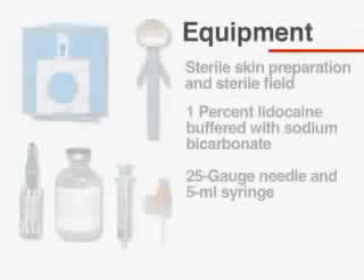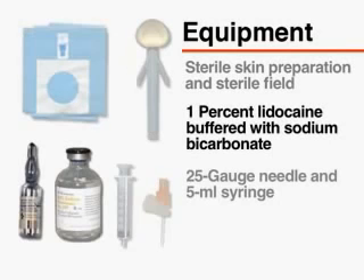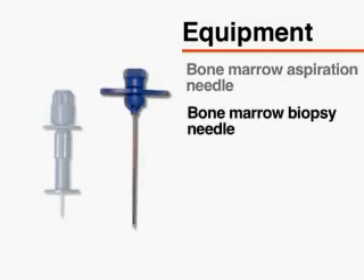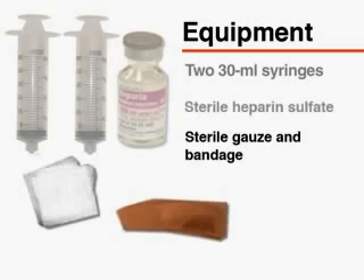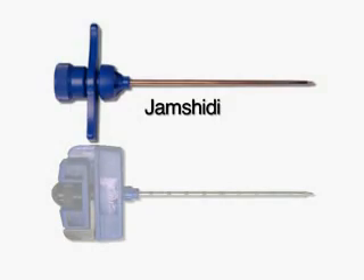Gather the necessary equipment prior to performing the procedure. You will require equipment for sterile skin preparation and a sterile field, 1% lidocaine buffered with sterile sodium bicarbonate, a 25-gauge needle and 5-milliliter syringe, a bone marrow aspiration needle, a bone marrow biopsy needle, two 30-milliliter syringes, sterile heparin sulfate, sterile gauze, and bandage. Several types of bone marrow biopsy needles are commercially available; this video will demonstrate the use of the Jamshidi needle for obtaining a core biopsy.